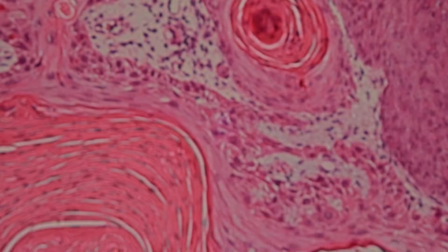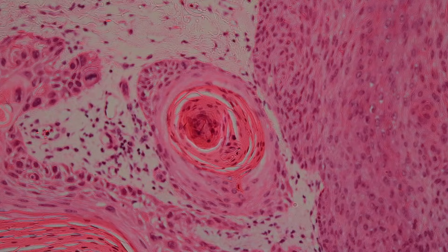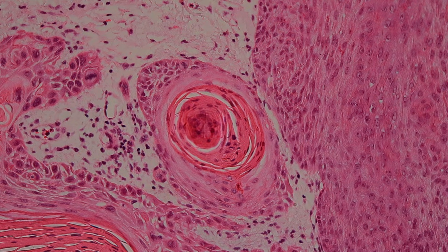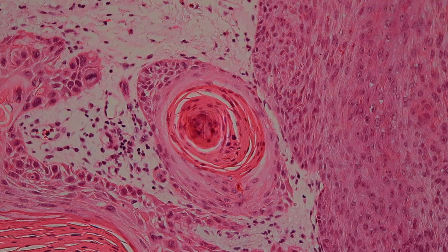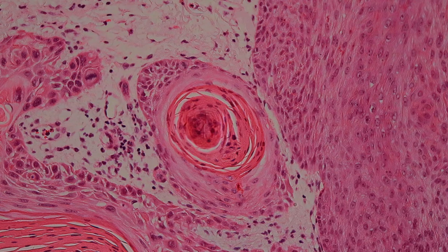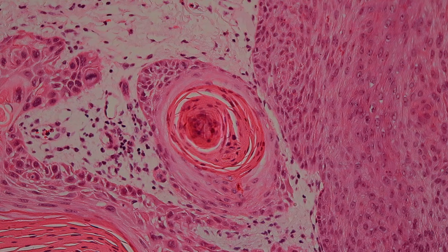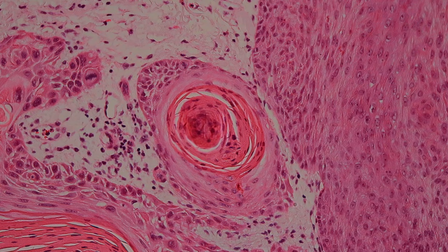Here's an example of a keratin pearl. The keratin pearl is made of dense pink keratin, and that keratin is sitting in the middle of an island of atypical keratinocytes that's down in the dermis. There are a lot of nuclei in there — so it's like parakeratosis, like you'd see parakeratosis on the surface of the skin. These keratinocytes are making parakeratosis that gets trapped inside the nests of tumor, and those little swirled entrapped aggregates of parakeratosis are what we call keratin pearls.